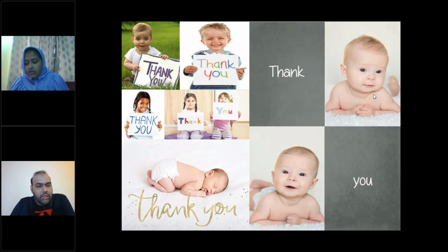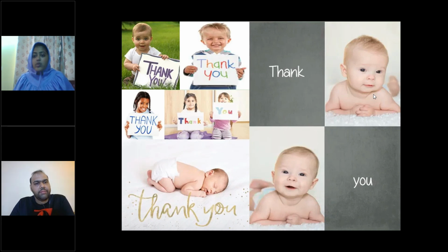Do you also perform book retinoscopy? Okay, so book retinoscopy is when you give different reading material, different sizes of reading material, to the child on the plane. It's just like how we do the dynamic retinoscopy, but in dynamic retinoscopy, we are putting in the plus. And with book retinoscopy, first we will check the reflex with the comfortable reading size that the child is reading very smoothly. Then we would go to the size which is like N6. Maybe the child is reading N6 and is comfortable to read that. It's the normal reading size which they use regularly. And then we go to a smaller size where they have to look intensely, and then do the retinoscopy.